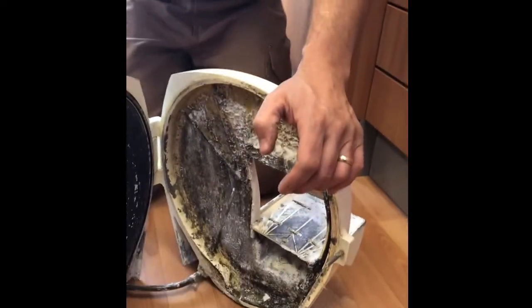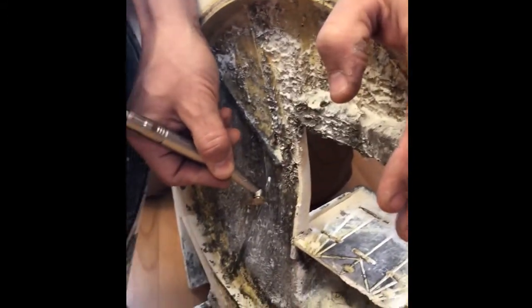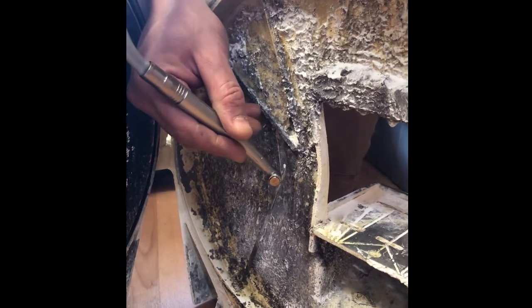All right, so now we have a high-speed handpiece with a cutting burr, and I'm just going to step on the foot pedal, and we'll cut right here. Now the handpiece will illuminate the area, so it should be fairly easy to see, and we're just going to cut the end off.